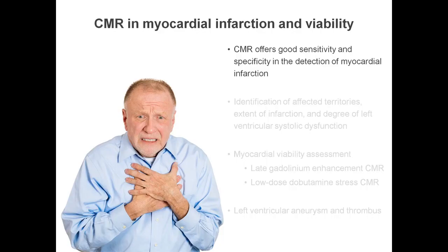CMR offers us good sensitivity and specificity in the detection of myocardial infarction. With CMR, we can identify the affected coronary artery territories, we can assess the extent of infarction, and also quantify the degree of any left ventricular systolic dysfunction.